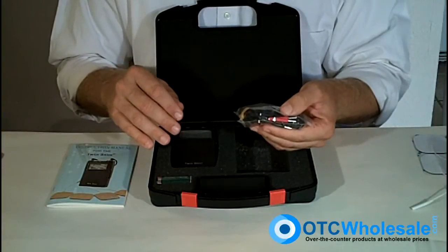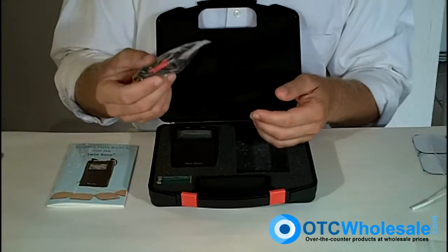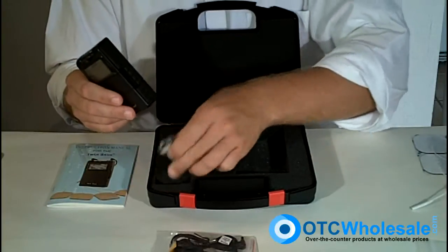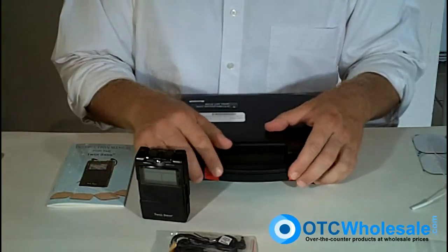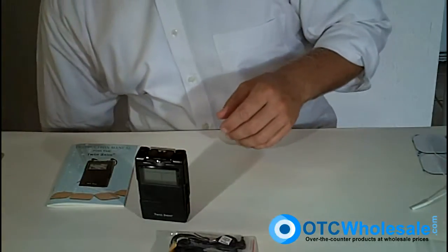It's a dual channel unit, so that means you can use either two electrodes or four electrodes — two electrodes per wire, so you get two wires in the package. The Twin Stim itself does not use an AC adapter; it uses a 9-volt battery, so you might want to consider getting yourself a rechargeable 9-volt battery. Of course, we have those at OTC Wholesale.